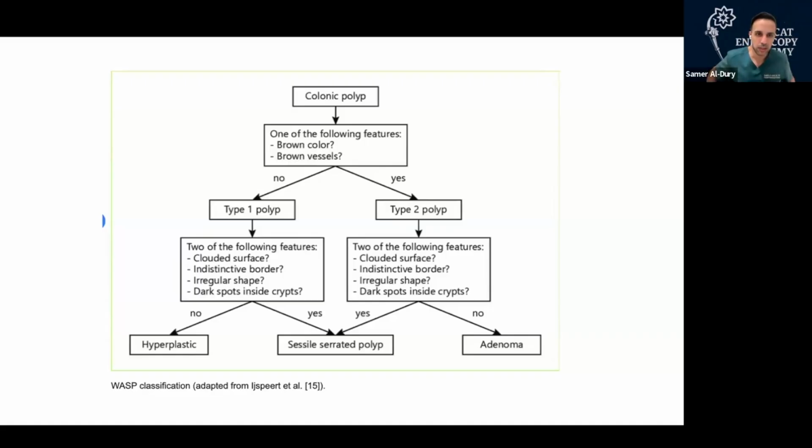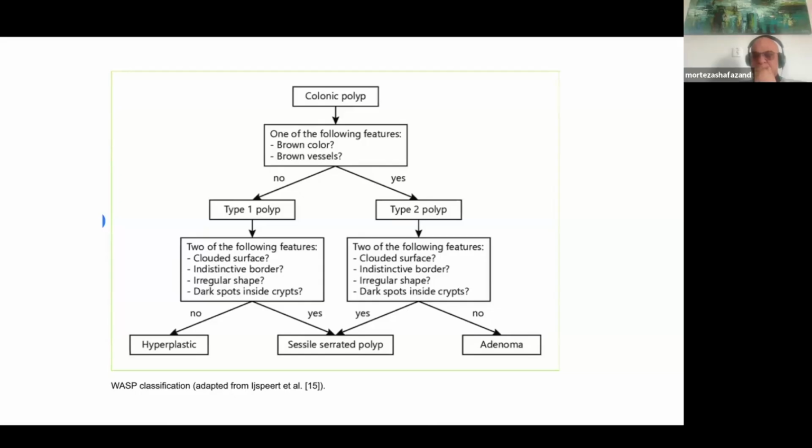But it really requires a clean patient, right? Quite often in real life you have many patients who do not have a clean right colon. They might be clean everywhere else except the right colon, or maybe they did not drink enough water to flush through the right colon. A regular scenario is that a patient is scheduled for colonoscopy at 9 a.m., but because of whatever delay, they're not scoped until 11 or 12. In the meantime, they're fasting.